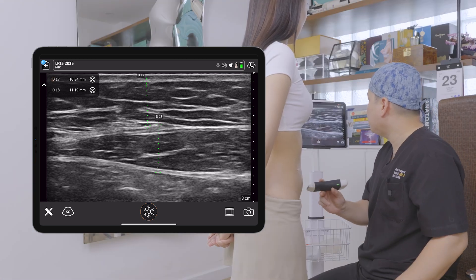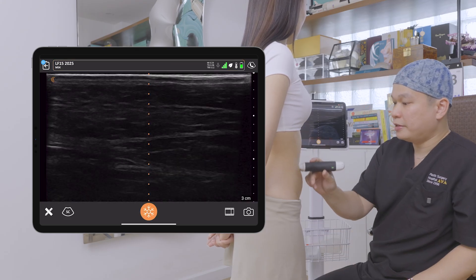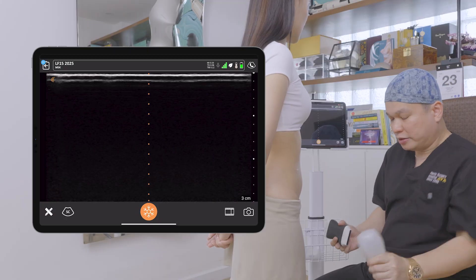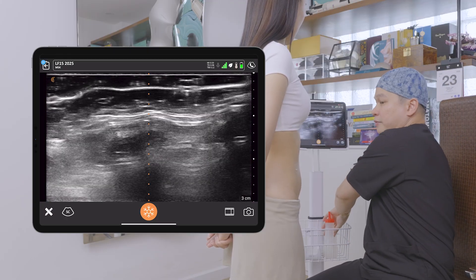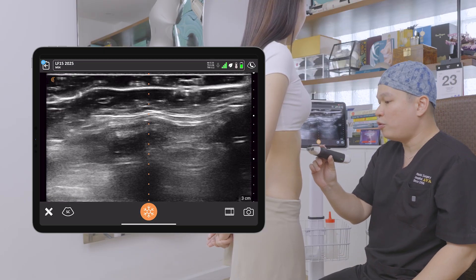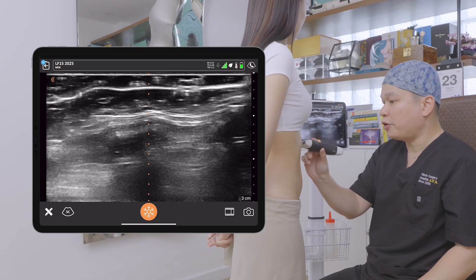I can capture this image and then resume my scan. Now we turn our focus on the linea alba, and this structure is very important. The linea alba is very important because it will be abnormal in patients who are obese or who are postpartum.